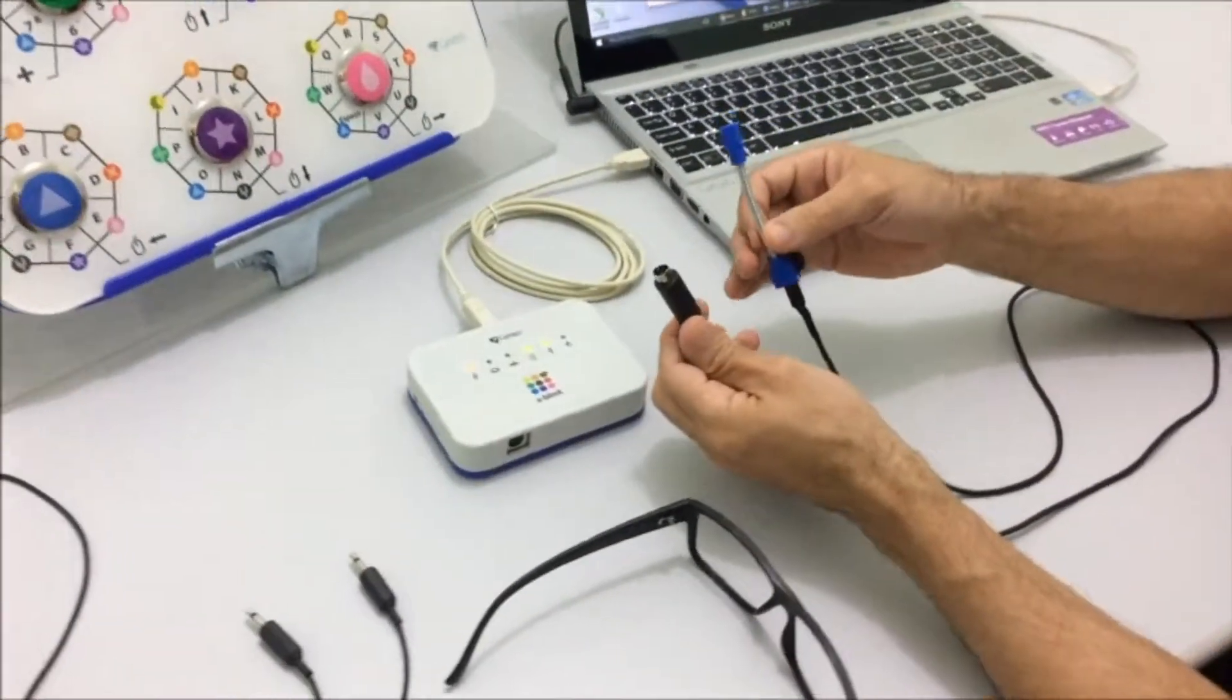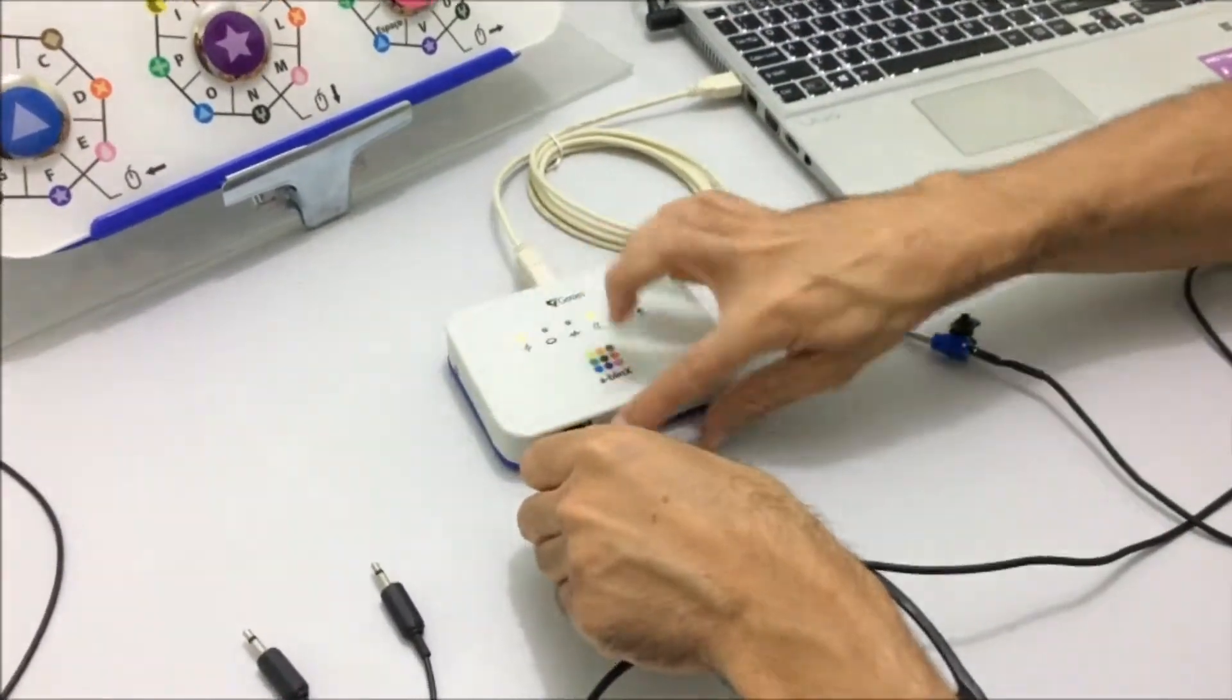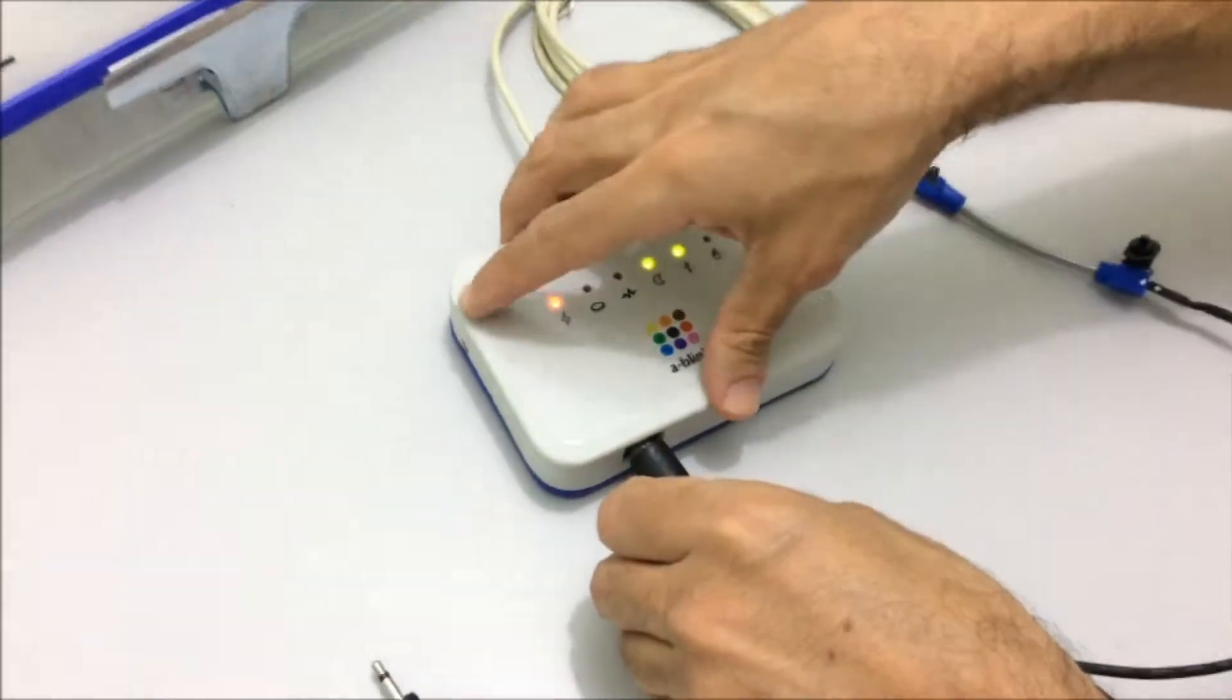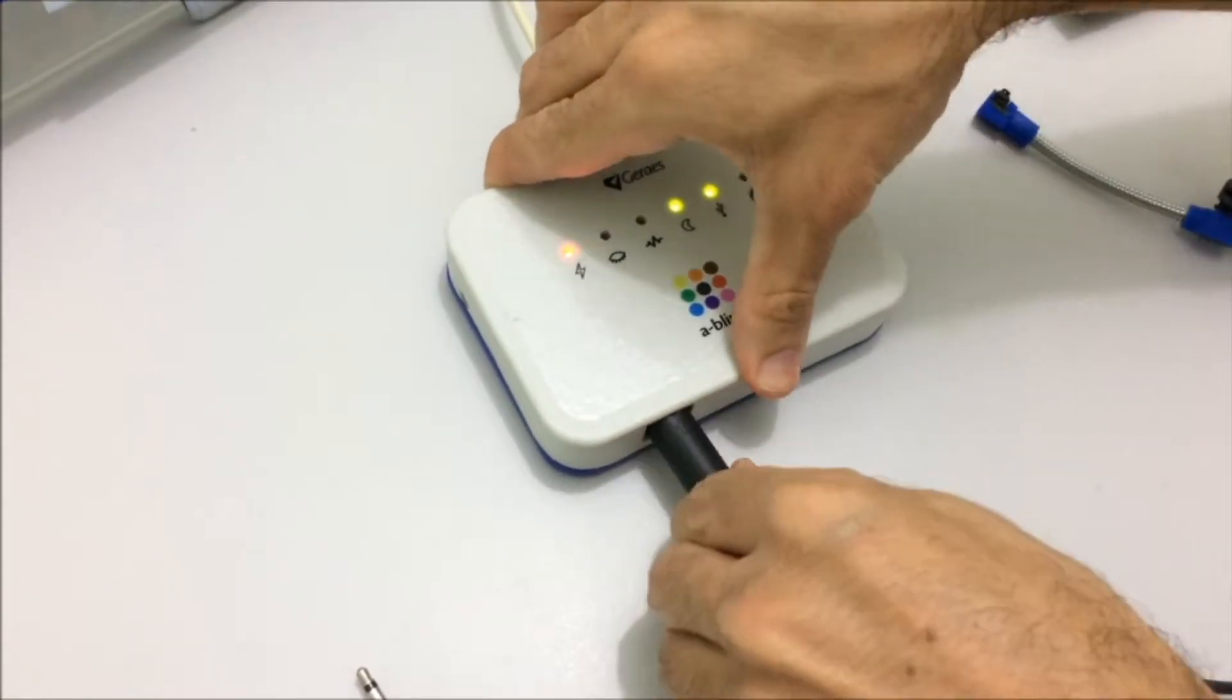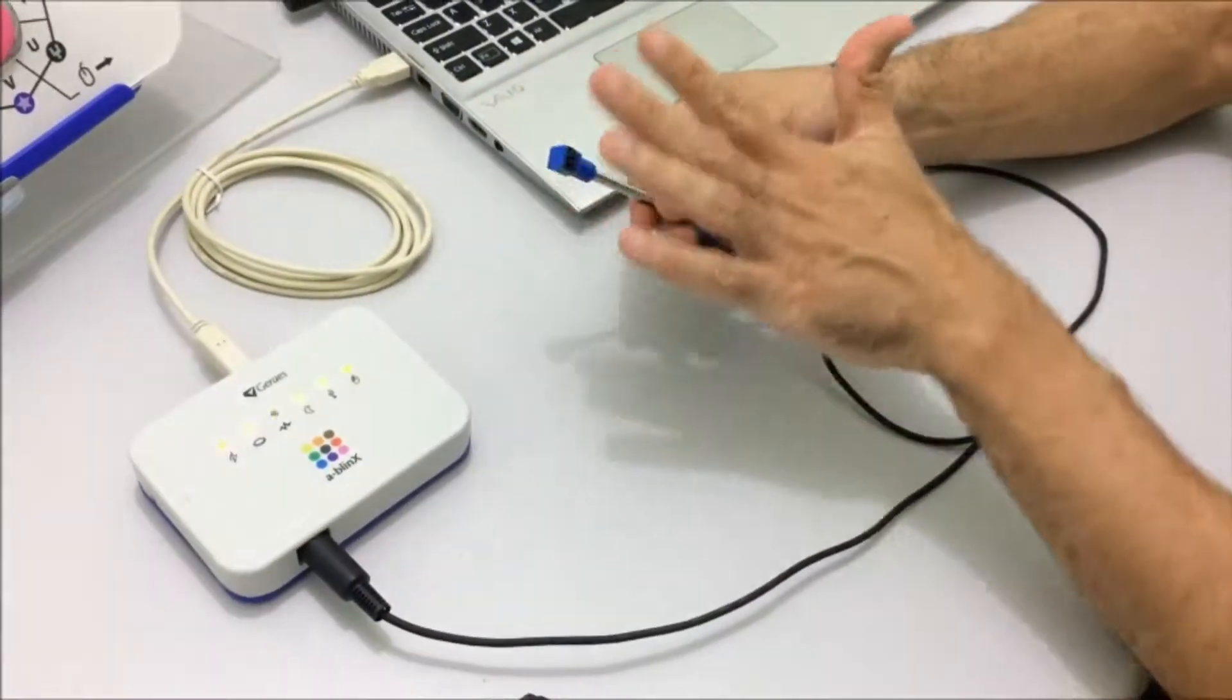Key X is already plugged into the computer as well through the USB port, and now we are going to connect the sensor that detects the eye blink. You just need to plug in this plug in the frontal port, watching for the arrow that has to be facing up.